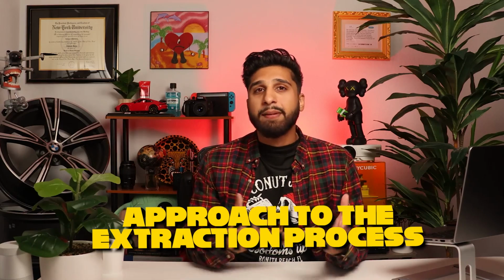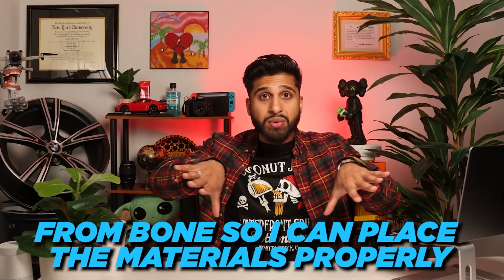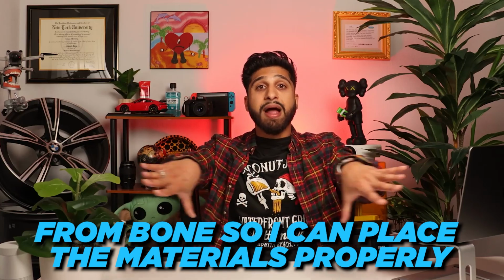Now, let's discuss my approach to the extraction process. Firstly, I prefer to flap the gums out of the way. This involves lifting the gingival tissue with the periosteal elevator. And if I'm going to use a particulate bone graft and membrane like I do in this case, I use a 15 blade to incise the gingiva to create enough separation of the gingiva from the bone so I can place those materials properly. Starting on the buccal side, I make an incision slightly distal to the extraction site and then extend that incision mesially.